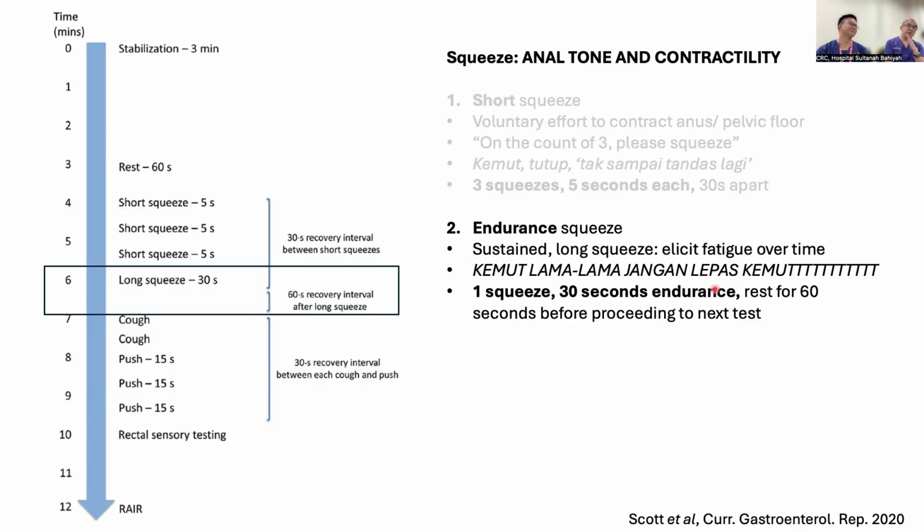And if the patient has a sensory problem, for example, constipation with hypersensitivity, you need to start thinking, could this be irritable bowel syndrome or not? Then we have drugs like neuromodulators that will be helpful for patients who have a rectal hypersensitivity. So all of these tests are useful to provide a much more holistic interpretation for the patient. Thank you. You had a question just now?